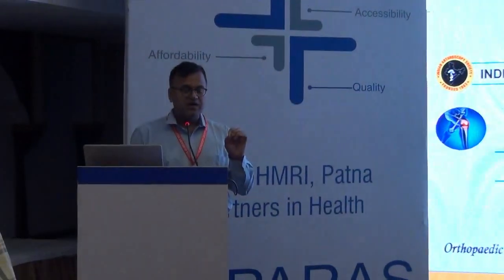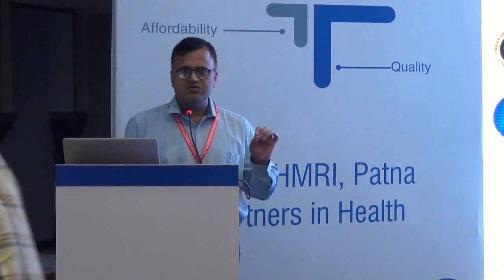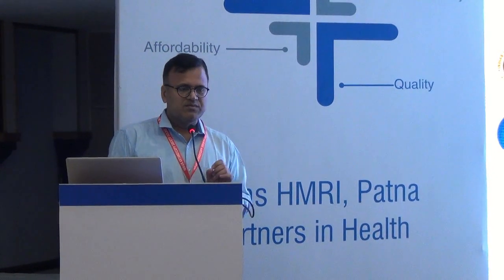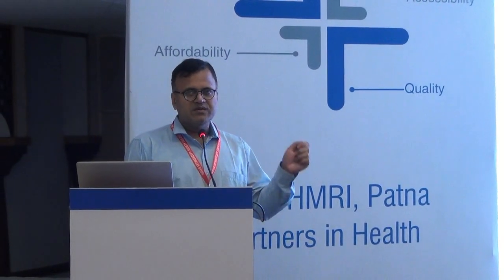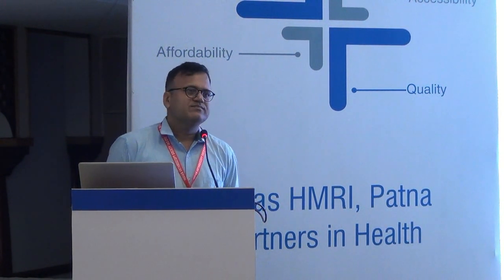Nowadays it is mandatory for me. Almost in all the cases I do repair, because if we leave both the leaflets, superior and inferior, it is just like a fish mouth appearance. There is gradual seepage of the joint fluid, and it leads later on to a parameniscal cyst, and definitely the patient has pain and symptoms like that. Another thing, these menisci are not healthy menisci. Here the collagen fiber is not normal as compared to the normal meniscus. So it is recommended to repair, close the mouth of that leaflet with the suture.